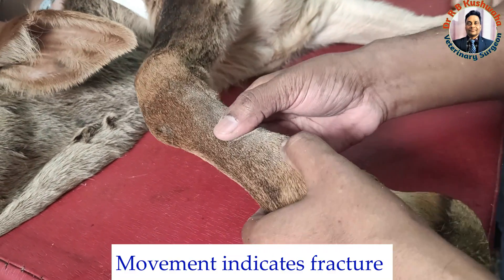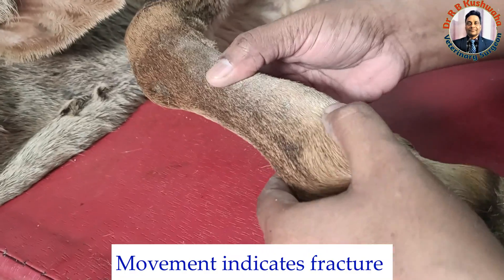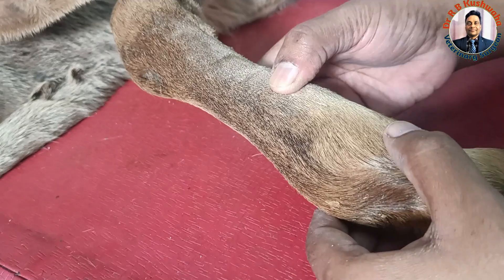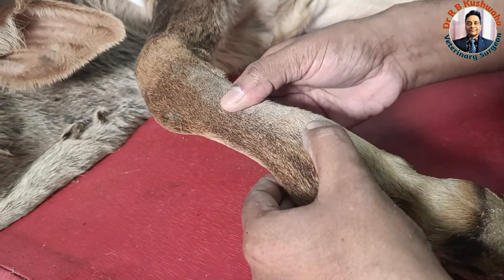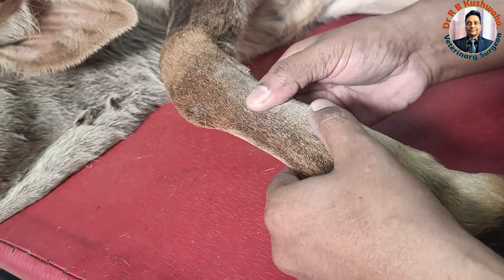The fracture is clearly visible here — you can see the clear-cut abnormal movement. The joint is here and here. This movement pattern is also one way to identify the fracture location.